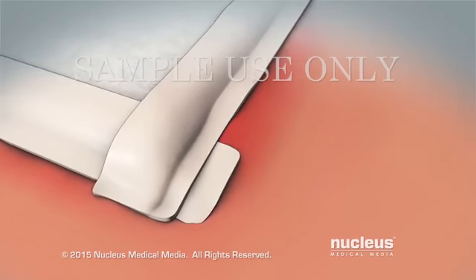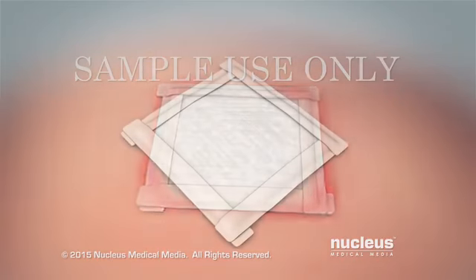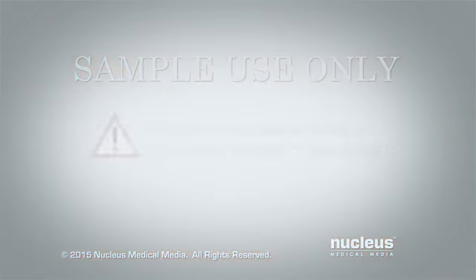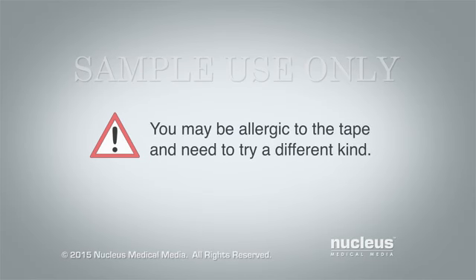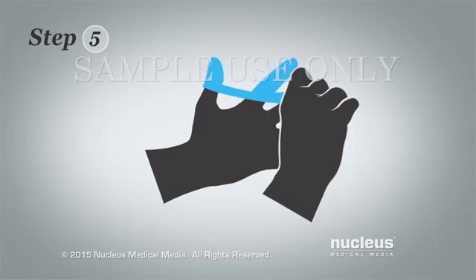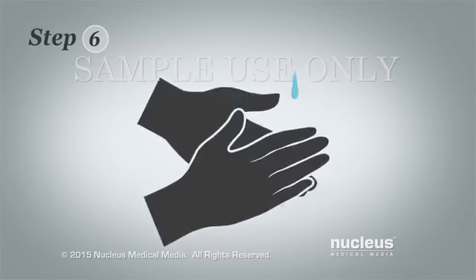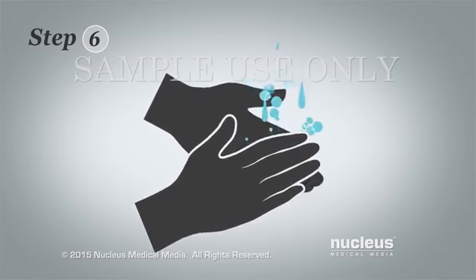If your skin is red from the tape on your old dressing, put the new tape on a different part of your skin. If your skin is swollen or has blisters, contact your healthcare provider. You may be allergic to the tape and need to try a different kind. Step 5. Remove your gloves and put them into the wastebasket. Step 6. Wash your hands again with soap and water and dry them.